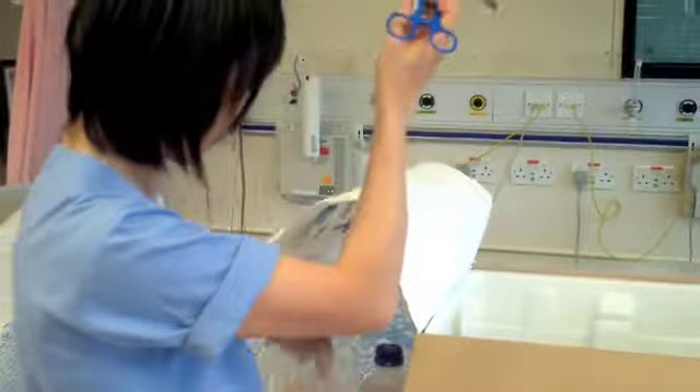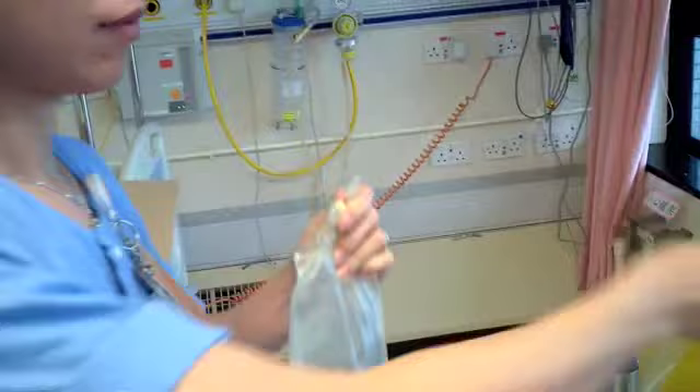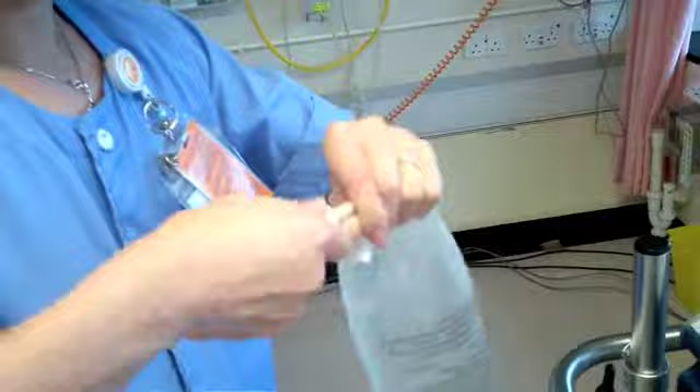Prepare the filling lines and the priming bag. Connect the spike to the supplied priming bag and hang the bag from a suitable point. We now use another filling line and connect it to a priming liquid. In this example, we use one liter of 0.9% normal saline as priming liquid.